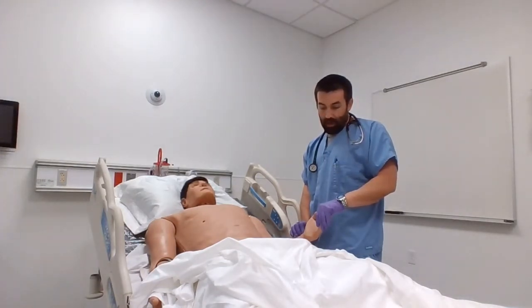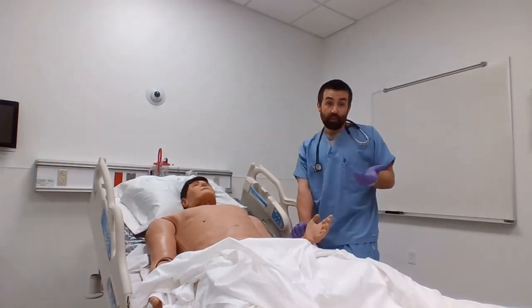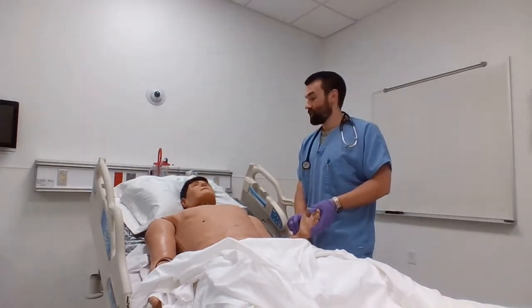Okay, so I ended up with 18 here. 18 times 4 essentially gives us 72 — so 72 per minute, which is normal. That normal heart rate is 60 to 100. I can say he's got a good strong pulse and a good rhythm.